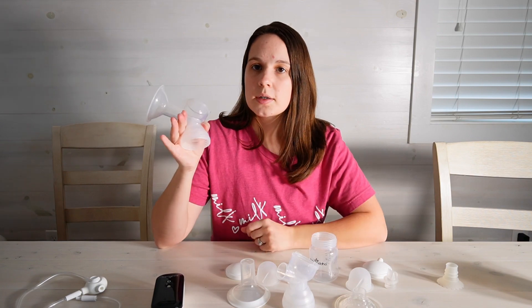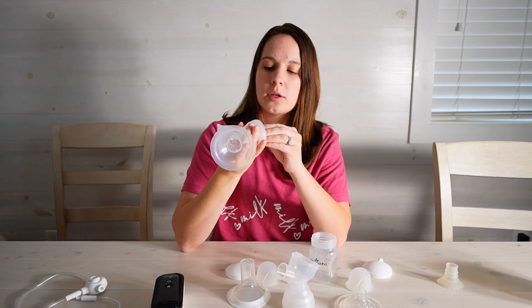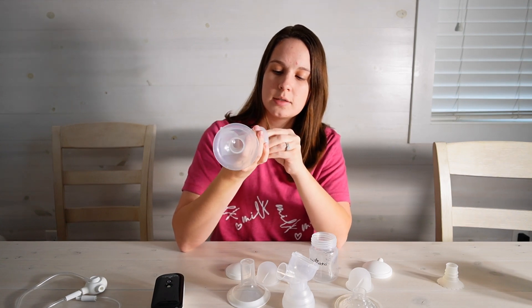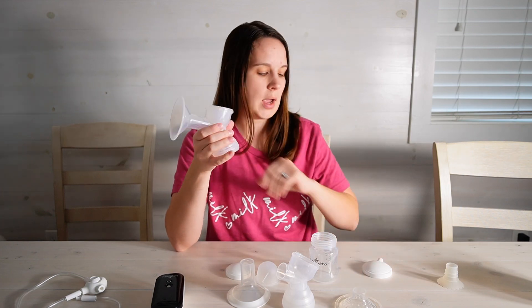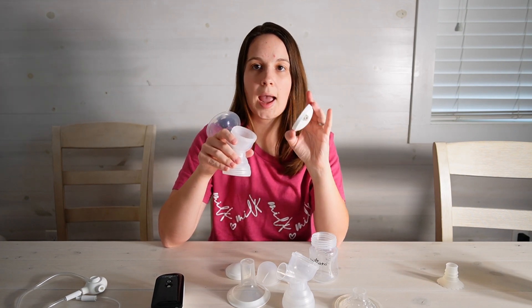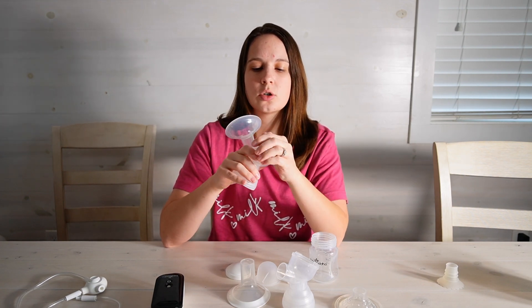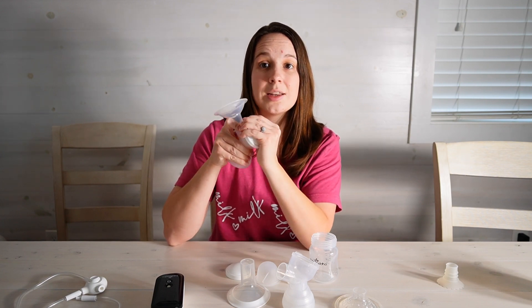For the part that comes with your pump we have the duckbill valve here. You want to make sure that that is in there all the way. You have your backflow protector or diaphragm. Now when it comes to your caps you want to make sure that you are pushing down and twisting.